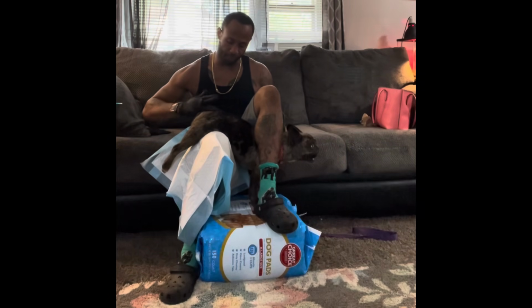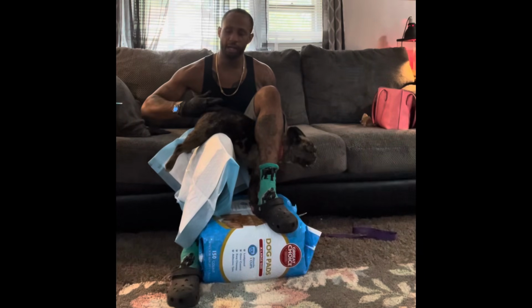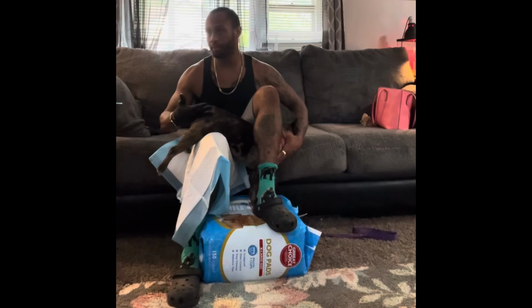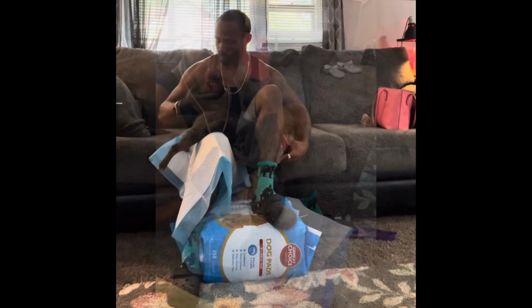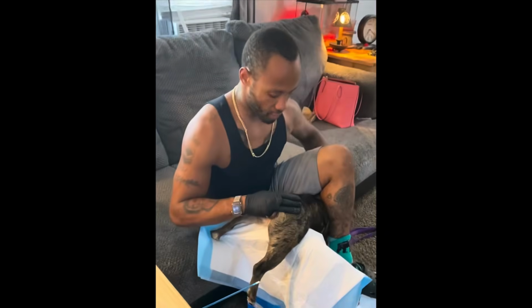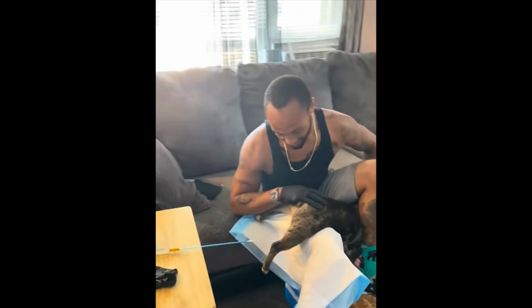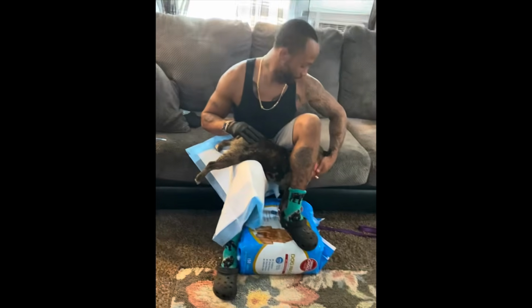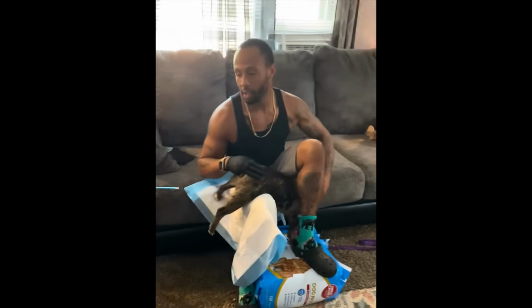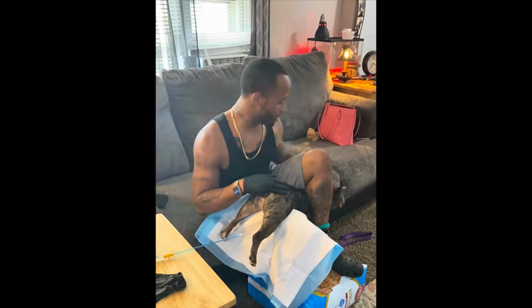I massage it a little bit. You can feel it with your finger, kind of where the catheter needs to go. So I'll sit here for a couple minutes like this, my finger all the way in, up to it. And I sit here and just relax a little bit. Sometimes you might need to talk to her, make her feel loved. Once you know you can move your finger and she's not jumpy or trying to pull away, you know it's about time where you can at least attempt to insert the catheter.